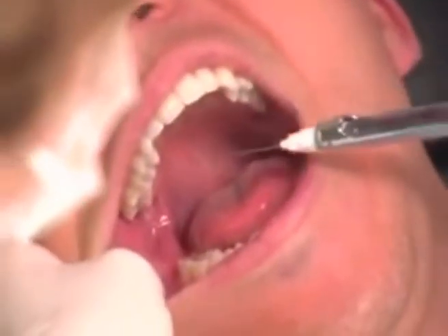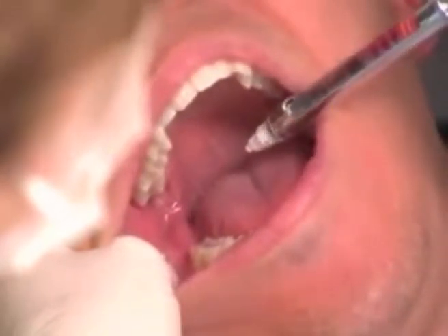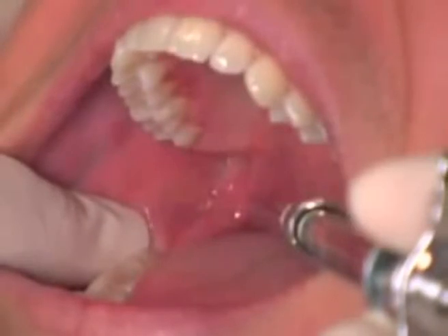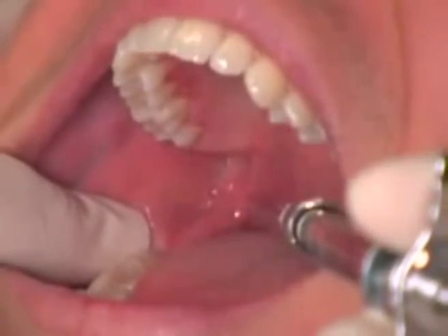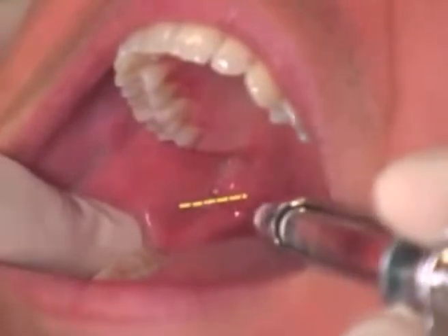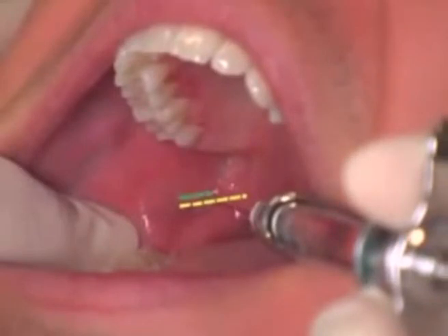The barrel of the syringe is placed in the corner of the mouth on the opposite side. The needle tip touches the most posterior aspect of the pterygomandibular raphe. The needle tip is then moved half the distance toward the coronoid notch and then half the distance back toward the raphe. This locates the injection site, which is 3/4 of the distance from the coronoid notch to the raphe.